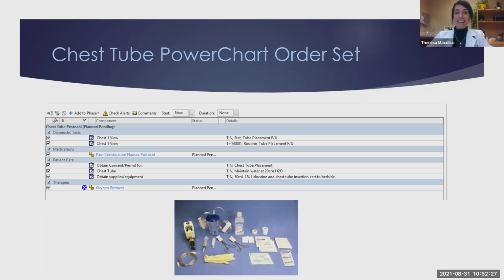Then you're going to get daily chest x-rays for the most part, just to ensure that the chest tube is still functioning and doing what it's supposed to, that there hasn't been, you know, a reaccumulation of pleural fluid in the space overnight. Maybe the chest tube's clogged, that kind of thing. Or sometimes you can see they have a chest tube in and they redeveloped like a large pneumothorax. So daily chest x-rays on a chest tube patient are very helpful.